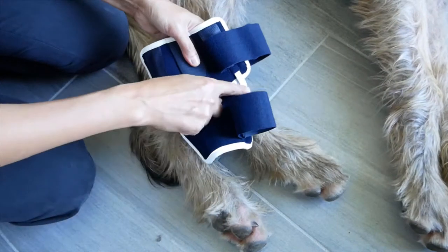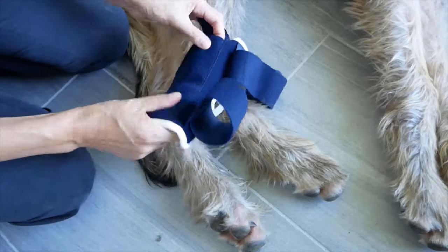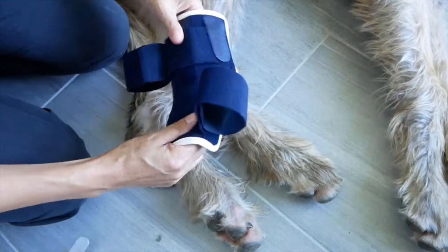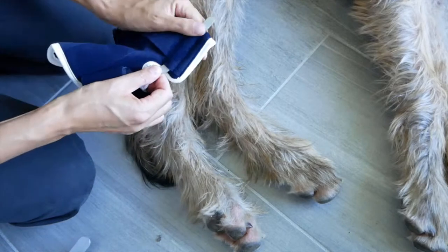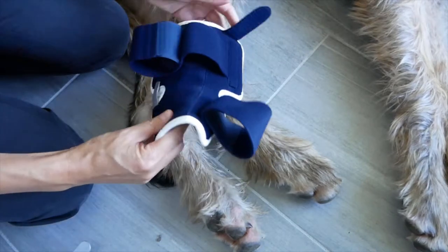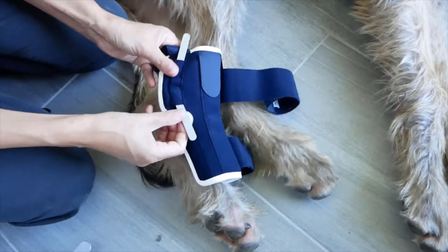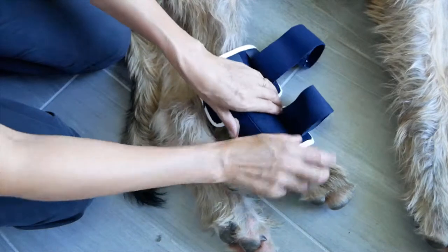The hock brace has three rigid splints. They are removable and allow the brace to be totally adaptable — from full rigidity to protect surgery implants, to mild support for arthritis management. You can adjust the support following the specific needs of your dog along their months of recovery. Check with your vet the level of rigidity required for your specific dog condition.